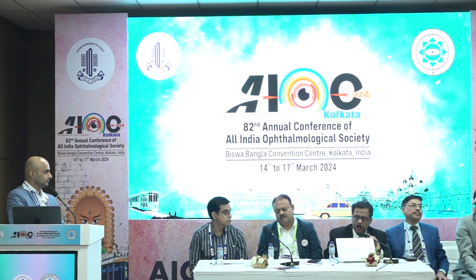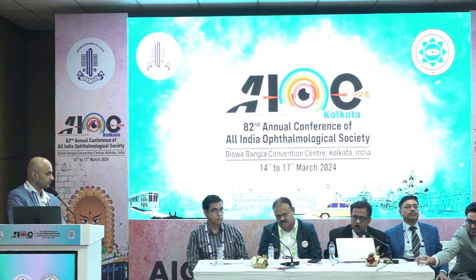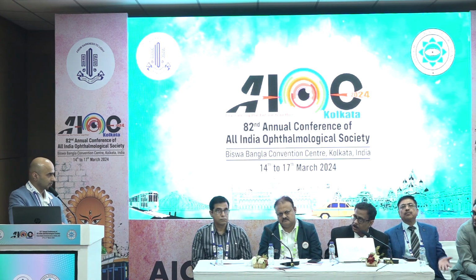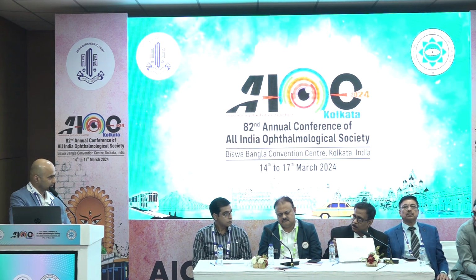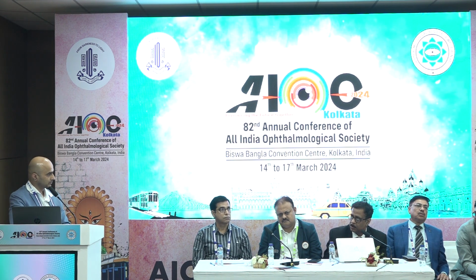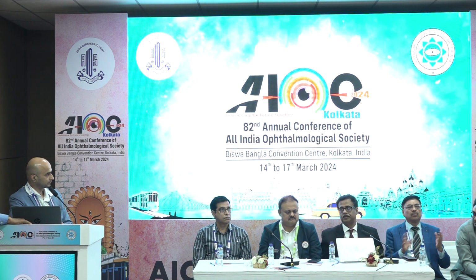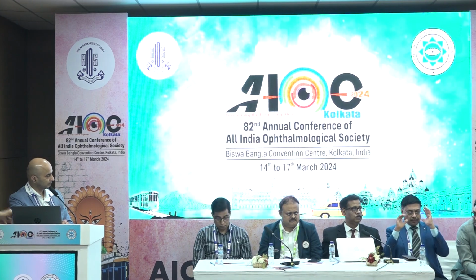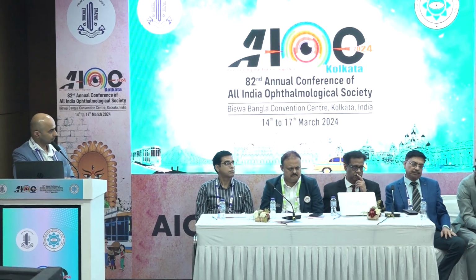And the most important thing, you have to remove the subretinal silicone oil not under air, always in fluid condition. Right. And also it is better to inject PFCL, as you have given, for complete removal of the subretinal silicone. In this case, Aditya could not avoid the posterior, but Professor Klaus Eckert says the retinotomies have to be as peripheral as possible, always.